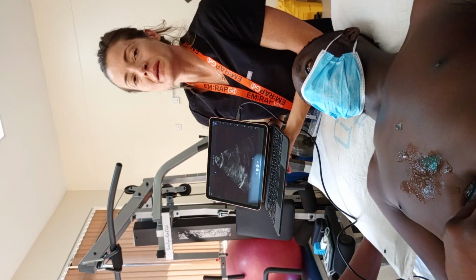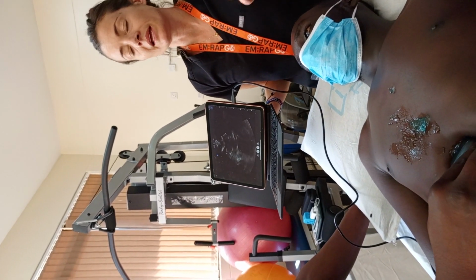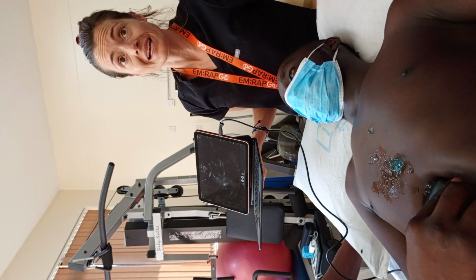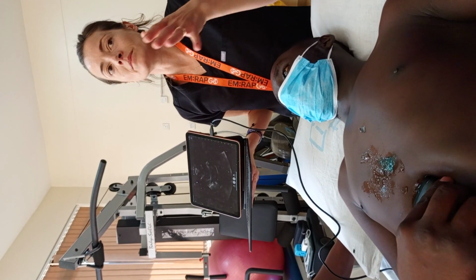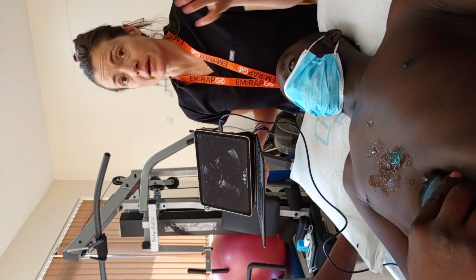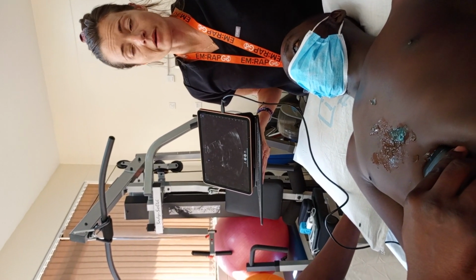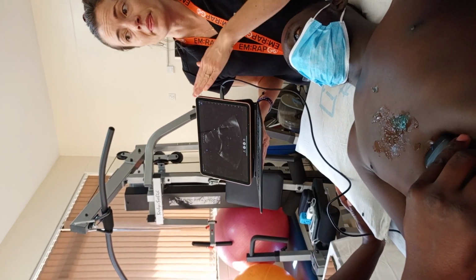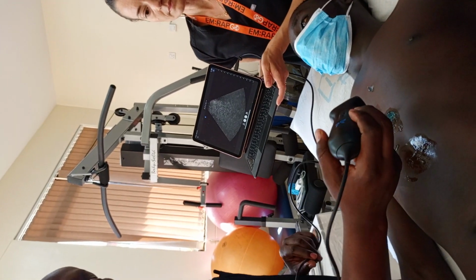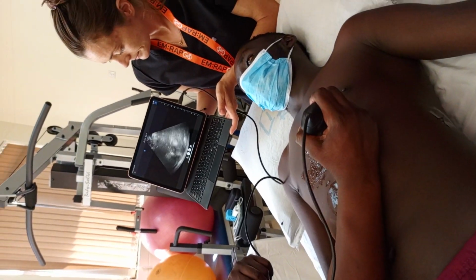This is not me trying to calculate their ejection fraction. It's nice to look and be like, is it normal looking like 60, or is it super reduced like 10? Then I'm more concerned. But really, I'm mostly just trying to assess very quickly, is there fluid in the pericardium? Is there concern that this person is going to develop tamponade or has tamponade physiology? And that's all I'm really looking at in this field. Can also try, there are many views for the heart. There's also this.